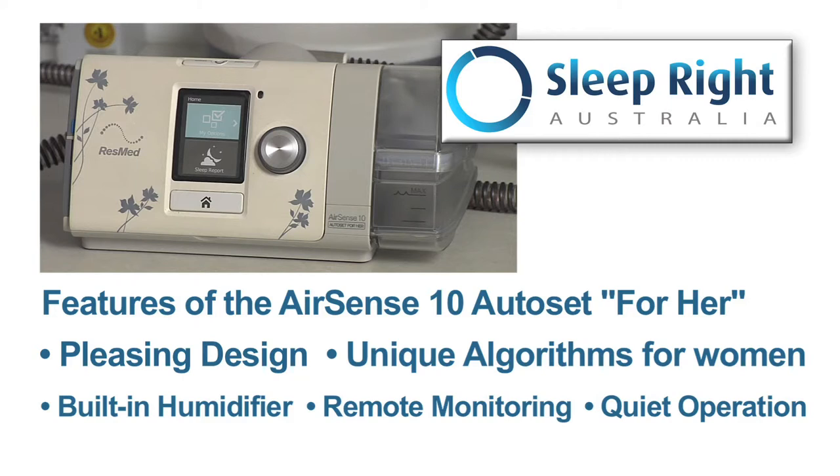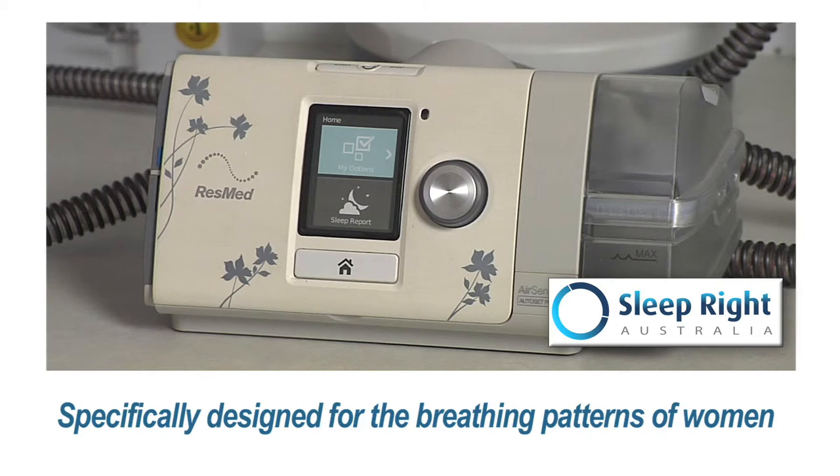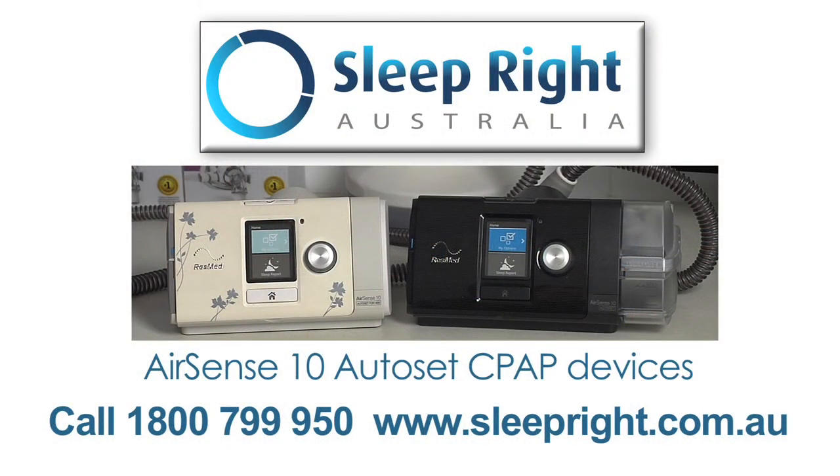As a general rule, women will have smaller lungs and a smaller airway. This machine is designed to specifically compensate for the differences between how women and men breathe. The algorithm inside this machine is designed to keep this in mind. If you have any questions about any of these devices, simply contact us at SleepRite Australia.